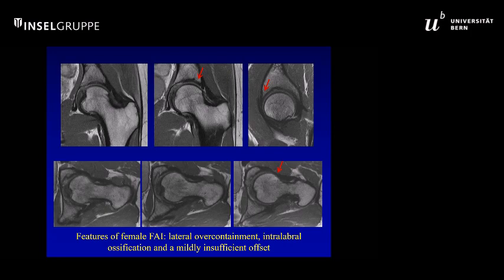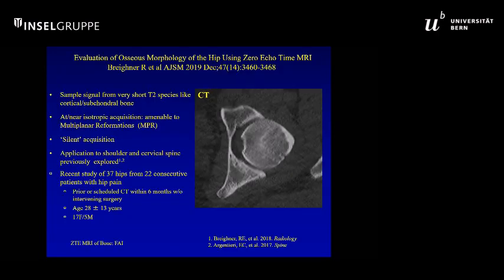So when you have all this wonderful information in MR, it's important to look at all the different pulse sequences to put the whole picture together. Bone typically on MR has very short relaxation times and therefore is typically seen as signal void or black on MR. Using newer pulse sequences, however, we can actually generate CT-like images.